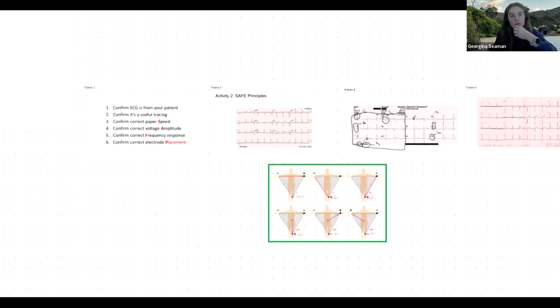Like it's just looking at that little bit. I'm such a visual person. I kind of have to see it in my head that V1's just looking at that bit of the heart, then V2 that bit, but it's not actually looking all the way through, is it?